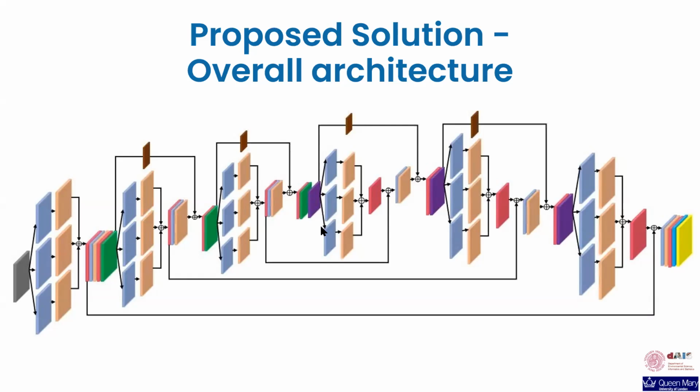We adopt several steps to achieve this, and the first of these is to keep a minimum use of pooling layers, which are used to reduce the dimension of feature maps. This is since these pooling operations also cause the loss of spatial information. Secondly, we employed multiscale kernels so as to account for large variations in retinal vessel sizes.